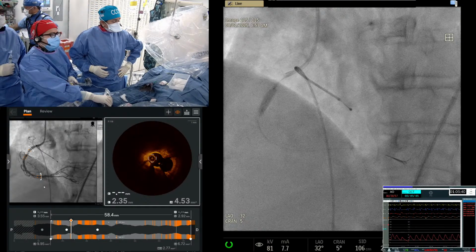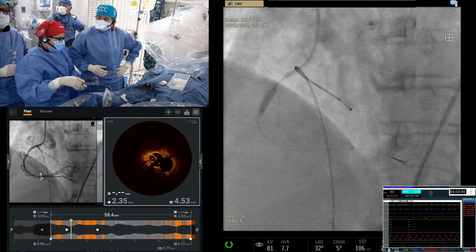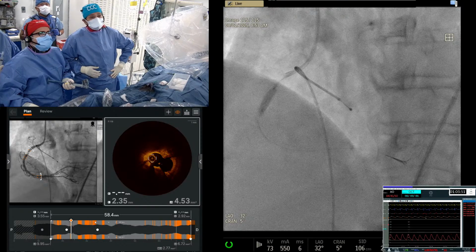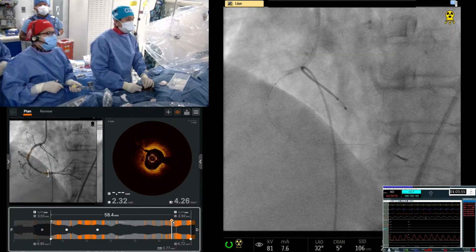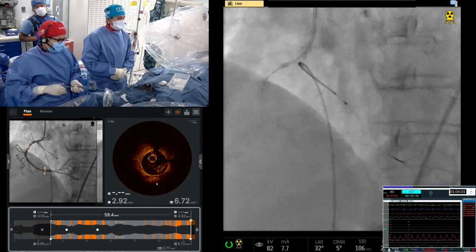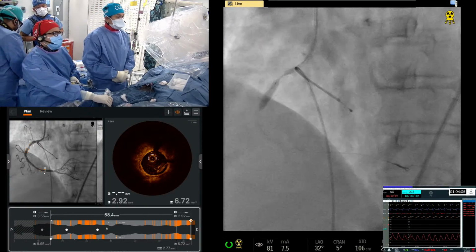From the OCT calculation, total lesion length is 58. This white line to white line is 58. Yeah, so 48 and 18 will cover. But normal to normal will be 48 plus 18. Yes, one stent cannot cover the total lesion. And actually, distal reference is on the calcium plaque, and lumen 3.0. If 3.5 is okay, like one size up. The mid part is full of vessel, of course, proximal.